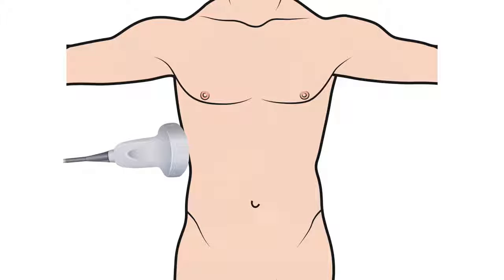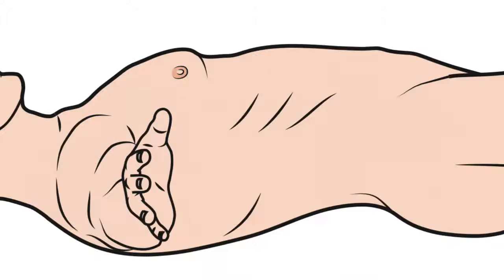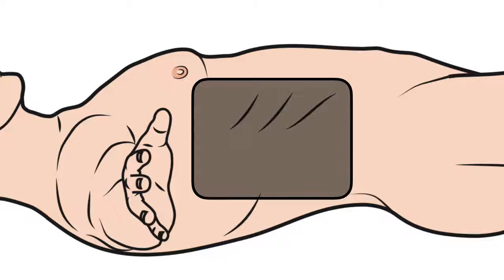Our next view is going to be the right upper quadrant, and this is a coronal view shooting from lateral to medial with the indicator pointed towards the patient's head. Now, one concern is that the ultrasound beam is very thin, somewhere between 1 and 1.5 millimeters in thickness. So when we're imaging in the right upper quadrant, we are only getting a very small slice. We have to image the entire right upper quadrant, looking in the lower thoracic cage, looking in the right upper quadrant around the liver, around the kidney, and in the paracolic gutter.